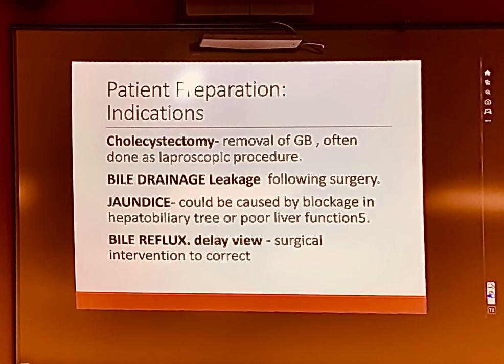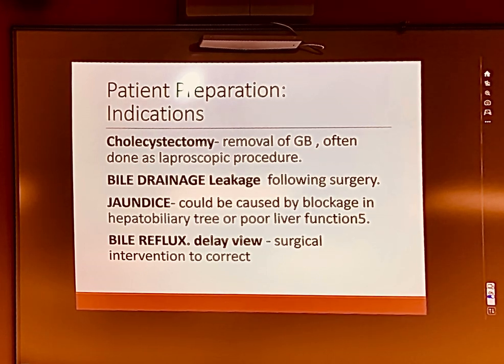And then you can have something called bile reflux. If you're looking for bile reflux, a bile reflux study is usually on smaller kids. We don't normally do that on adults unless they've had a Roux-en-Y gastric bypass.